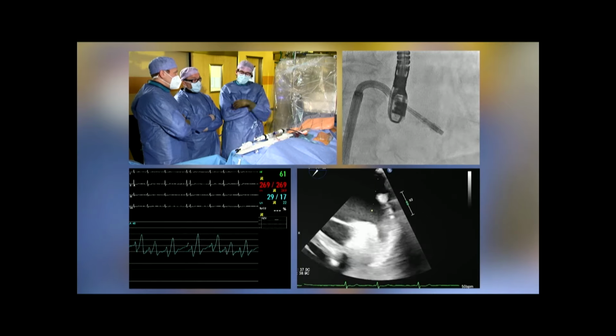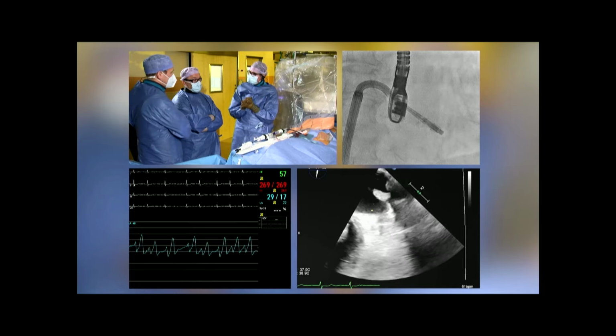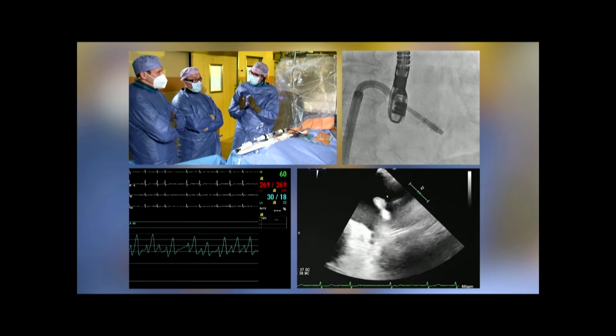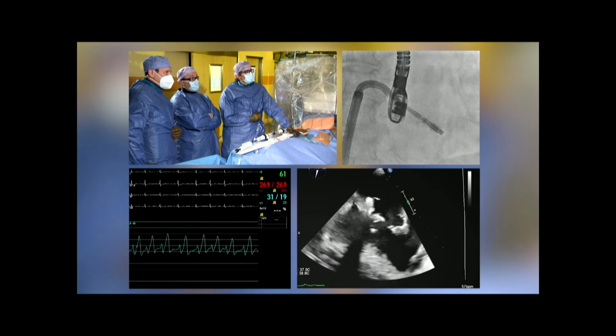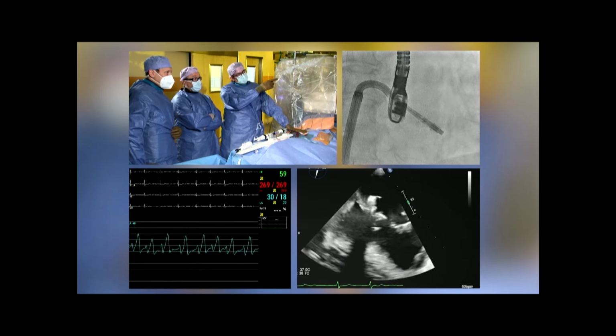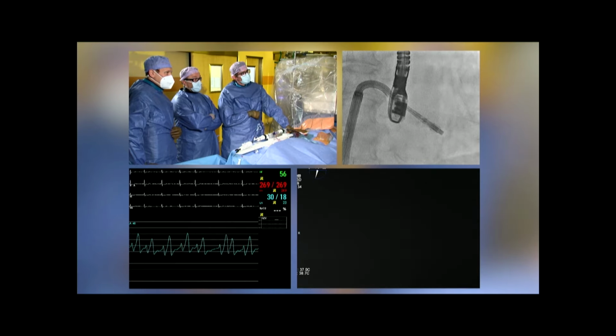Yeah, from a morphology, anatomy point of view, you would think that we add another one to stabilize it. But then you would like to have this one to be even more medial. I totally agree. Of course, the mitral valve orifice is large enough, so we can still place the second one without having a significant gradient.